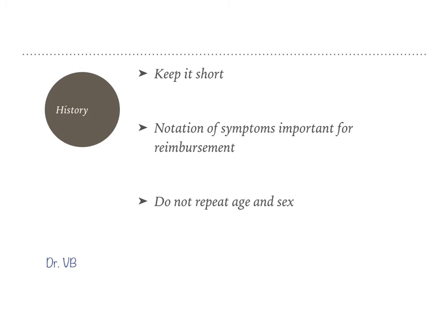History is the clinical details or the clinical information that is provided to us prior to doing the examination. So it is important to keep it documented. Because that is not information that we have found, since it is something that has come to us, try to keep it short. It is documented because it is necessary for reimbursement by insurance companies. And if in your header the age and the sex of the patient have already been revealed, do not repeat them again.